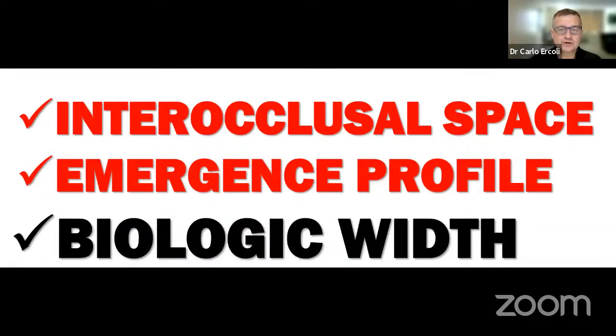So if we look at posterior implants, there are three things, among others, that come to mind. One is the availability of interocclusal space. You need to have the place for the crown. I know it sounds redundant. It sounds obvious, but you'll be surprised how many times implants go in place and there has been no plan, no thought as to how much space you need for the actual prosthesis. Let's remember, people don't come for implants, people come for teeth.